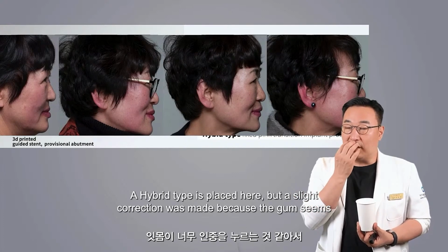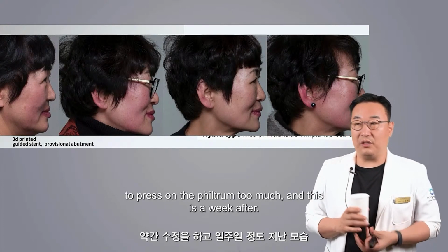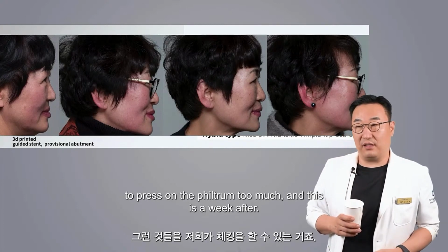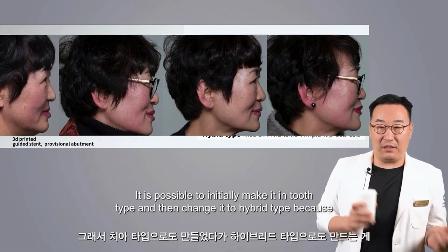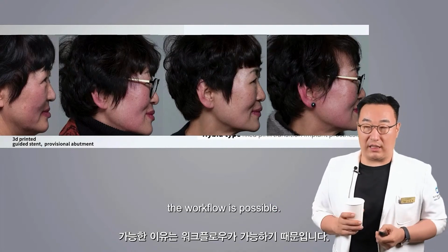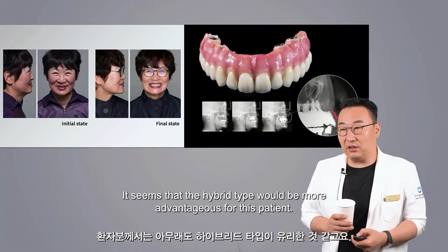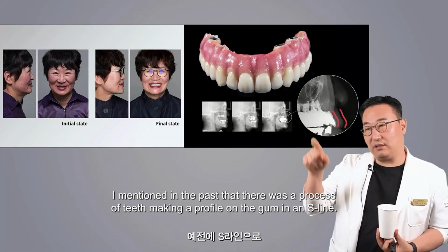A hybrid type is placed here, but a slight correction was made because the gum seems to press on the philtrum too much, and this is a week after. We can check these things. It is possible to initially make it in tooth type and then change it to hybrid type because the workflow is possible. It seems that the hybrid type would be more advantageous for this patient.